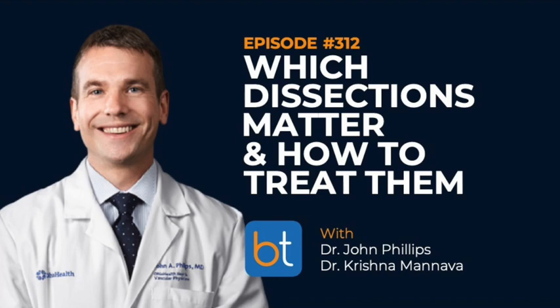Because if I feel like I need more than 6, then I'm going to put a stent in. Or I'm going to use a stent someplace and maybe put the tacks in a no stent zone or something like that. When we deploy stents in the leg, we're often taught don't leave little gaps or gap areas between some of the stents. What about with tacks?